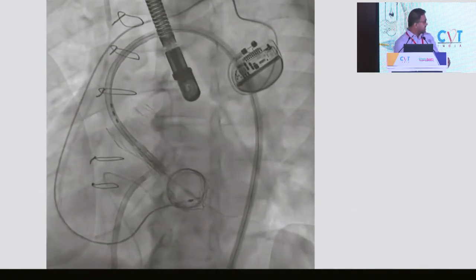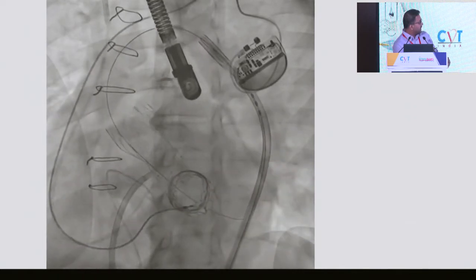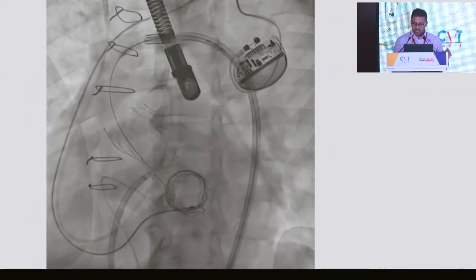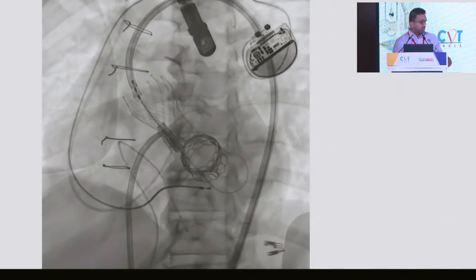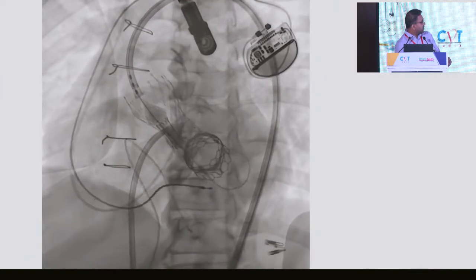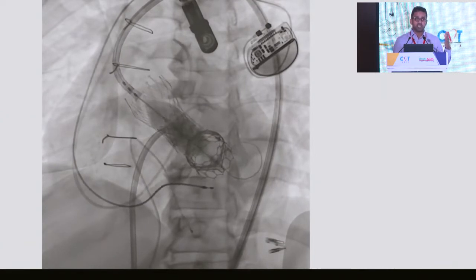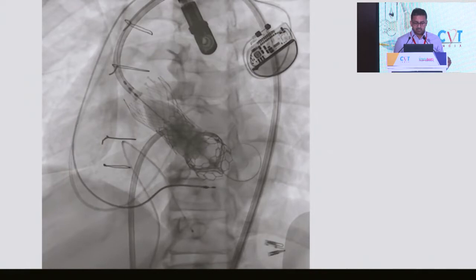So the plan now is to implant it exactly where the lower border of the valve is going to be at these markers, and the upper is going to be below the coronaries. That's the target, and that's the endpoint to be achieved. And here you can see rapid pacing. We know where the coronaries are. We know where the markers are. I have not put a pigtail because I didn't see the need for that, because I can see there's nothing moving. It's a fixed target. So it's a single axis TAVR in this case.